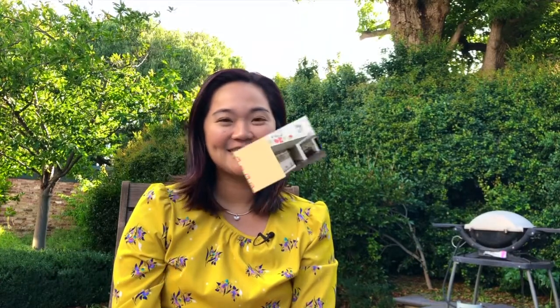I'd like to take you through a common gynecological procedure, a hysteroscopy, in today's video. So stay tuned after this.